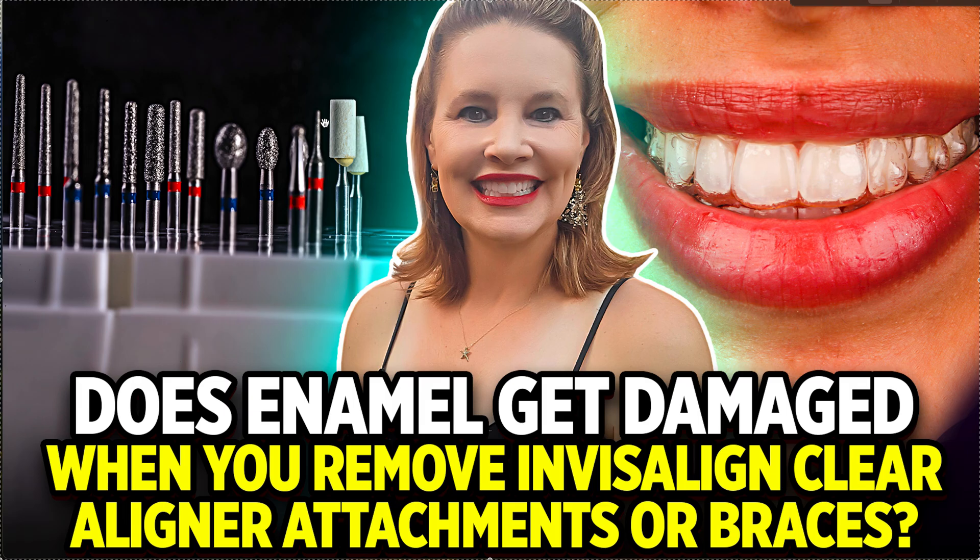Same thing with a stone — it's going to be very, very slow. You can also switch to slow speed, which is a lower RPM, so it's less likely to remove enamel. The key point is that enamel is harder than the stone, so the stone can't really take off enamel — it can only take off composite. Enamel is not harder than diamond, which is why a diamond burr can take off enamel.